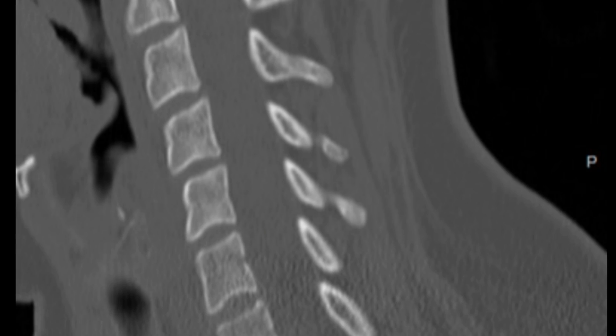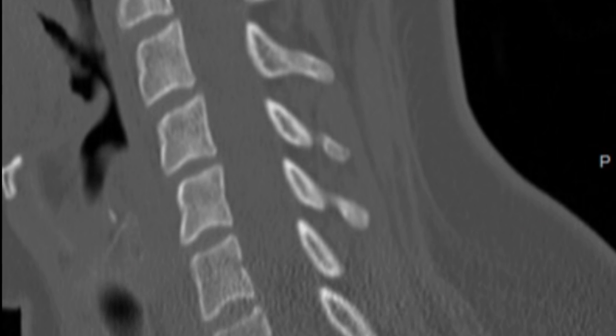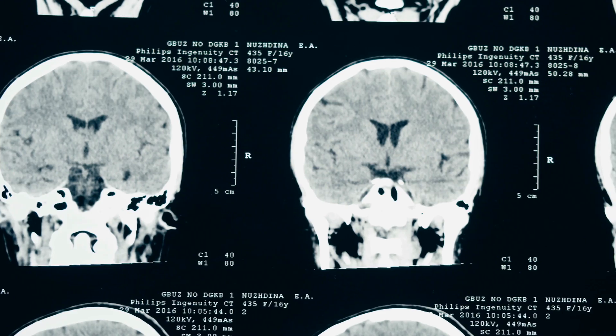Hounsfield units typically go from minus one thousand to over one thousand in the human body. If you were to display an image over that whole range, you would not get very good contrast resolution. The ability to see soft tissue structures would be limited — you would be able to differentiate things like bone and air in the lungs, things that are very different in contrast.